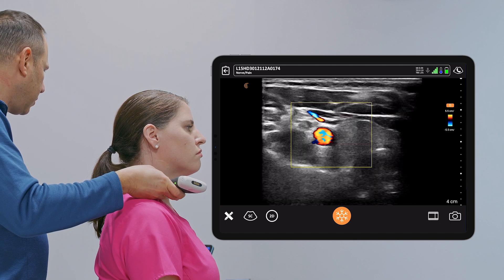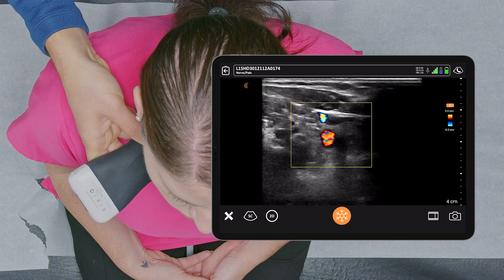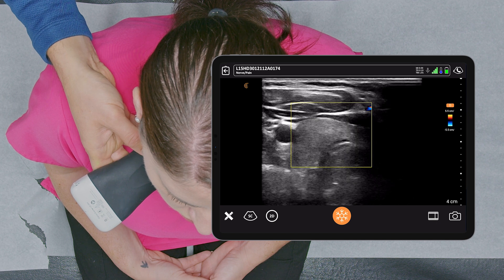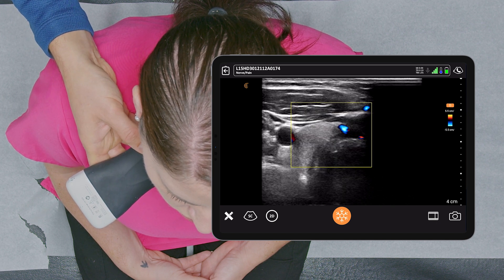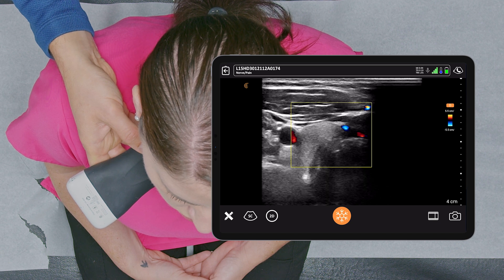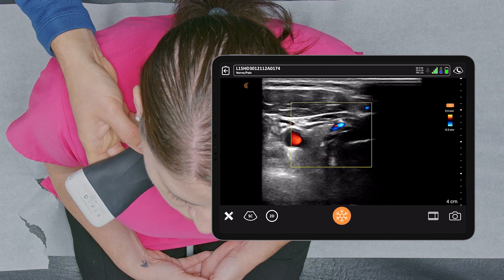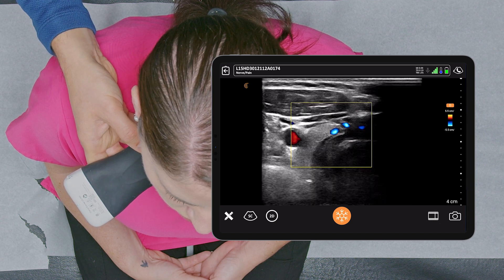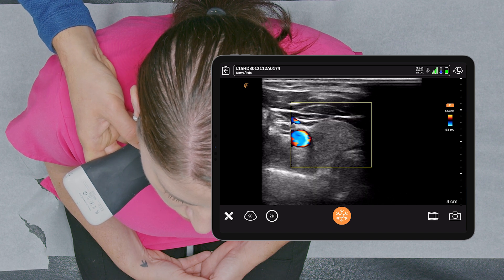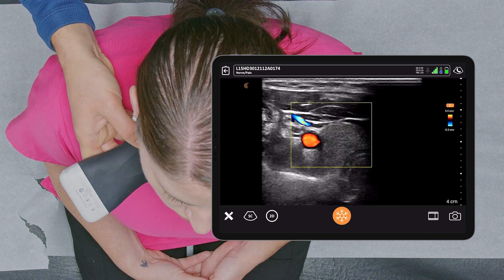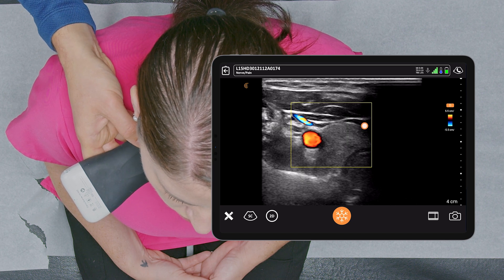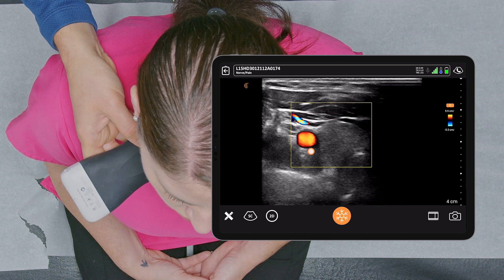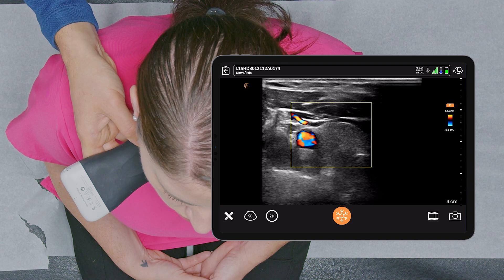Here's the vasculature, and I'm searching for the thyroid vasculature. There is some blood flow more medial to the thyroid. We're seeing a blood vessel inside the thyroid at the top — this is probably the superior thyroid artery. So this would be an ideal location for this stellate ganglion block if we were to go transthyroid. I normally use a 25-gauge, one-and-a-half-inch needle — it's usually long enough to get to the posterior border of the carotid artery and anterior to the longus colli muscle.